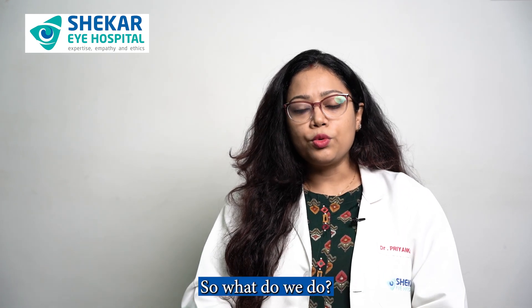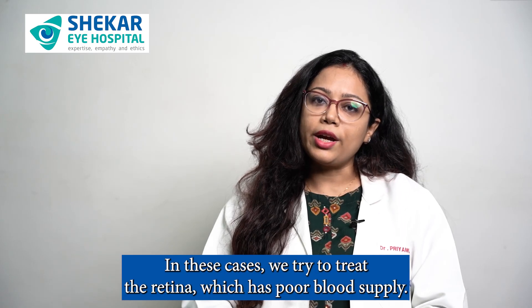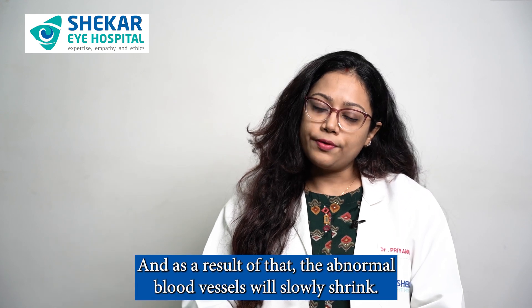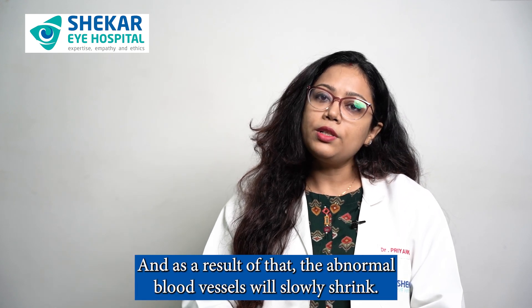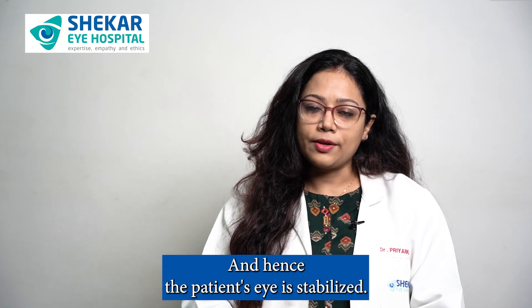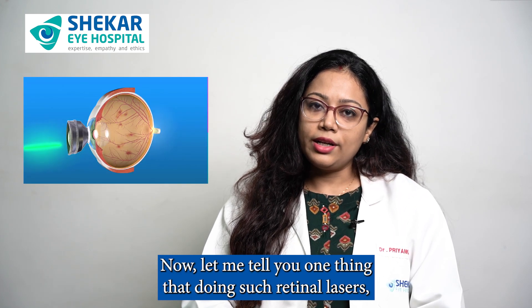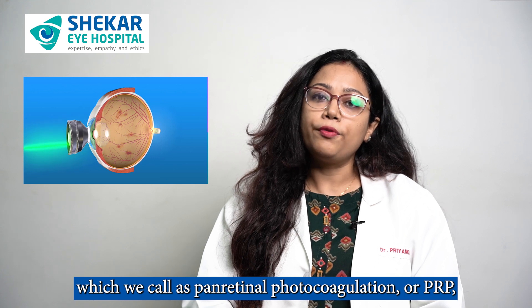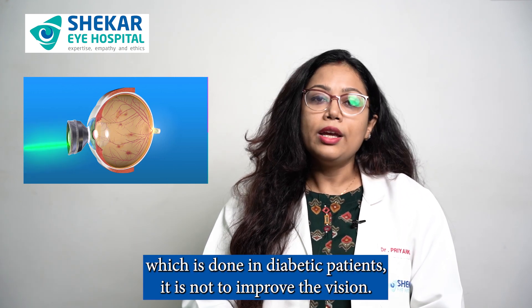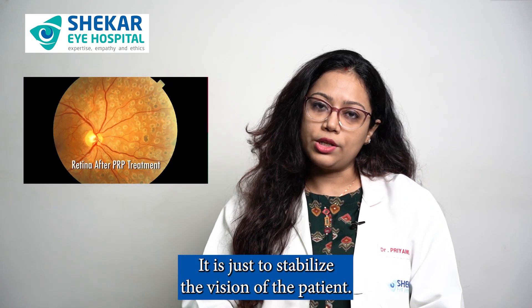So what do we do? We do retinal lasers in such patients. In these cases, we try to treat the retina which has poor blood supply, and as a result the abnormal blood vessels will slowly shrink and hence the patient's eye is stabilized. This retinal laser, which we call pan-retinal photocoagulation or PRP, is done in diabetic patients — it is not to improve the vision, it is just to stabilize the vision of the patient.